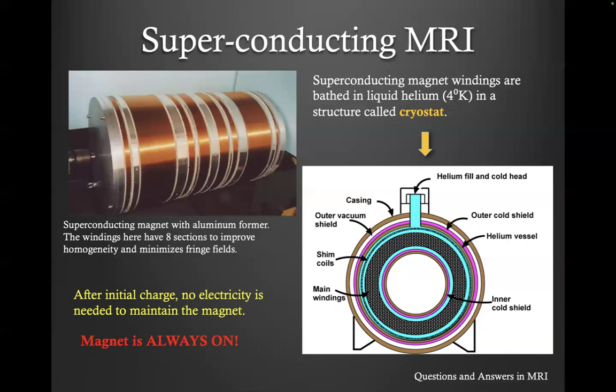So the danger of that is the magnet is always on. Even if you power off the scanner and everything, your magnet will always be on. There's no off plug for that. And if you go inside an MRI room, you're going to hear this chirping sound, like ch ch ch ch. That's actually the cold head pumping the helium in and circulating it out.